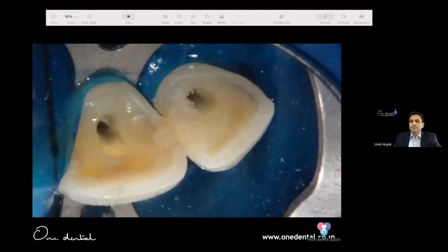Here's another picture. You see the small bubbles on the lateral? When that stops coming, you know the bacteria is taken care of. There's no oxygen liberation. The chemicals are not reacting anymore. You need to have a clear fluid. When bubbles are coming, they're still liberating oxygen. Till then, you should keep activating. That's the rule of activation. And that's a biological concept.